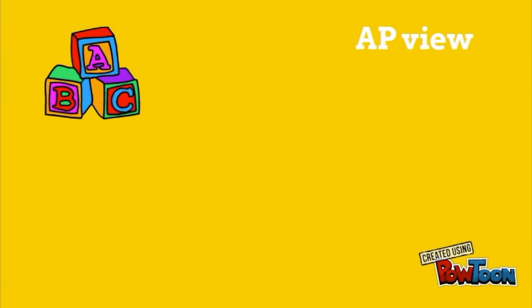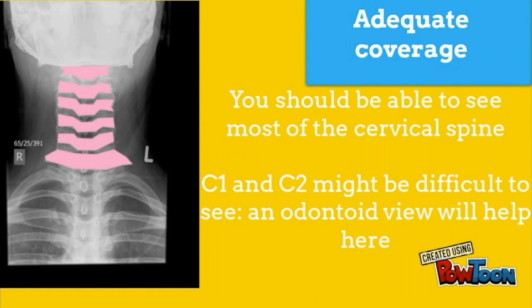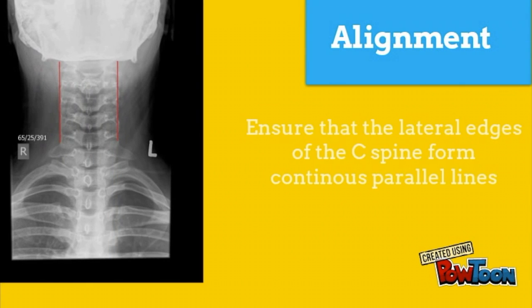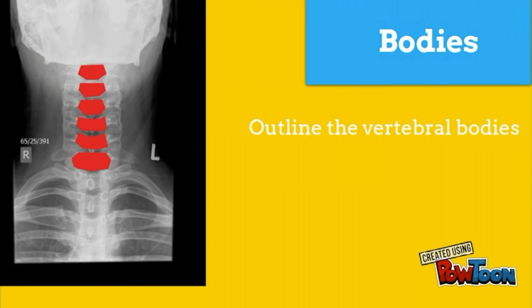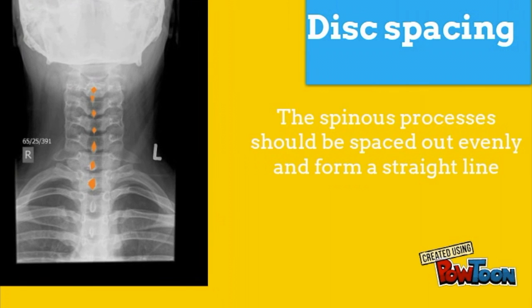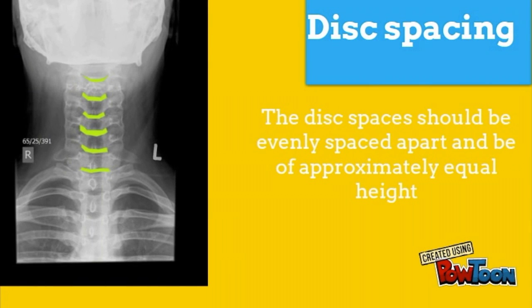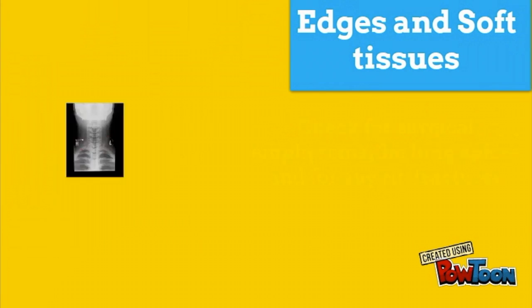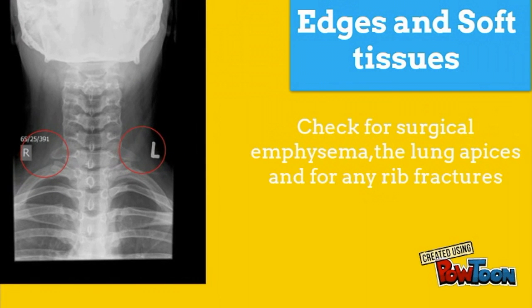Now we'll look at the AP view. Remember to follow your ABCDEs. Adequate coverage: you should be able to see most of the cervical spine; C1 and C2 might be difficult to see, and an odontoid view will help here. Alignment: ensure that the lateral edges of the C-spine form continuous parallel lines. Bodies: outline the vertebral bodies. Cortical outlines: outline the cortices of bone, but remember it is more difficult to see a fracture in this view. Disc spacing: the spinous processes should be spaced evenly and form a straight line, and disc spaces should be evenly spaced and of approximately equal height. Edges and soft tissues: check for surgical emphysema, the lung apices, and for any rib fractures.